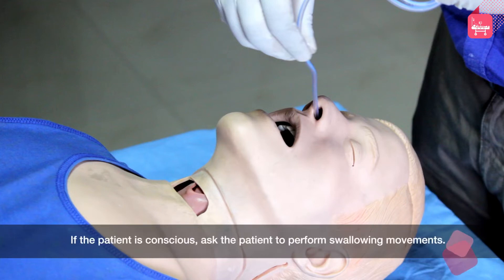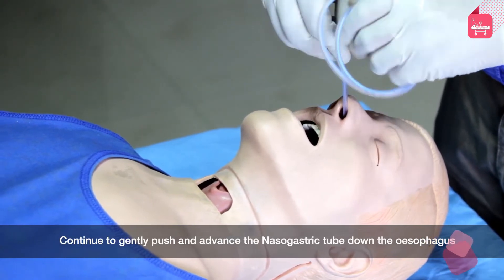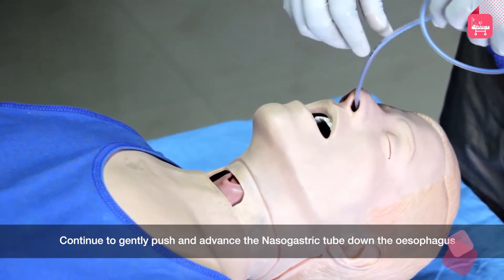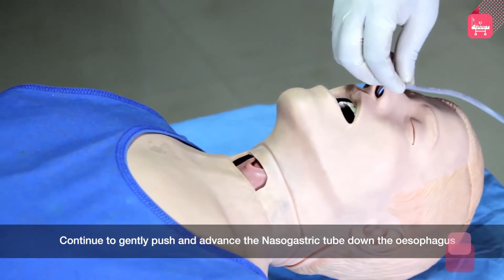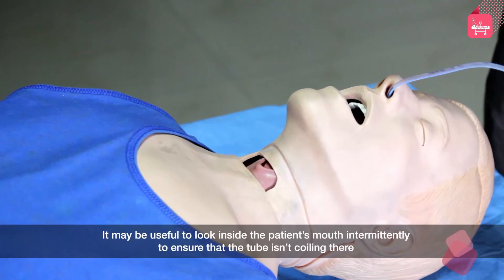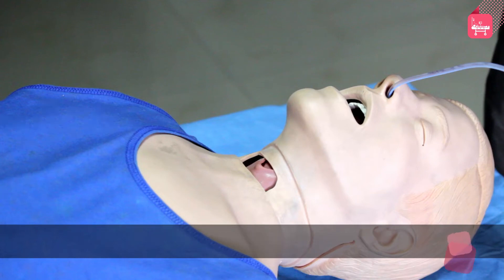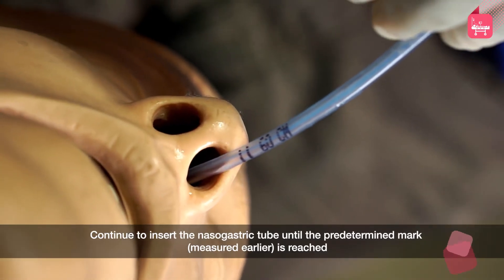If the patient is conscious, ask the patient to perform swallowing movements. Continue to gently push and advance the nasogastric tube down the esophagus. It may be useful to look inside the patient's mouth intermittently to ensure that the tube isn't coiling there. If the patient becomes distressed or gags, pause and allow the patient to relax. Continue to insert the nasogastric tube until the predetermined mark measured earlier is reached.